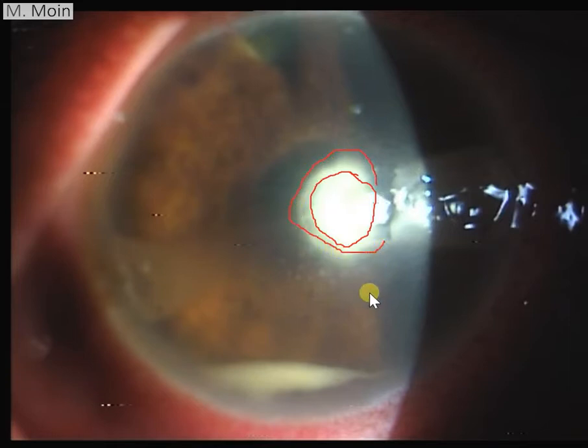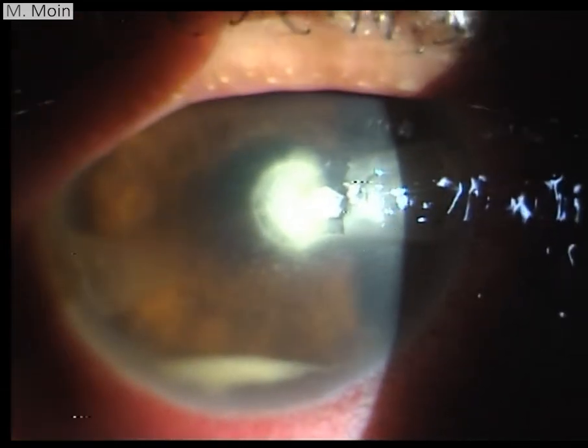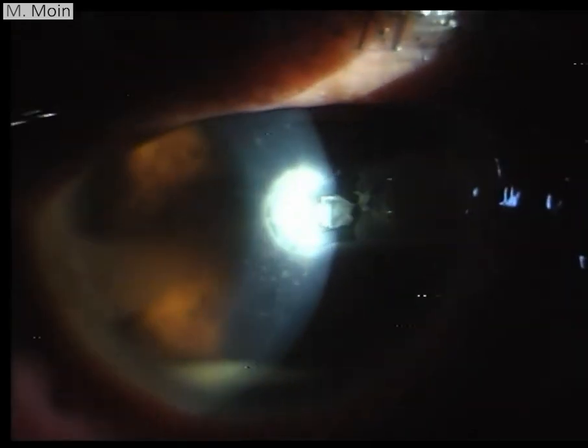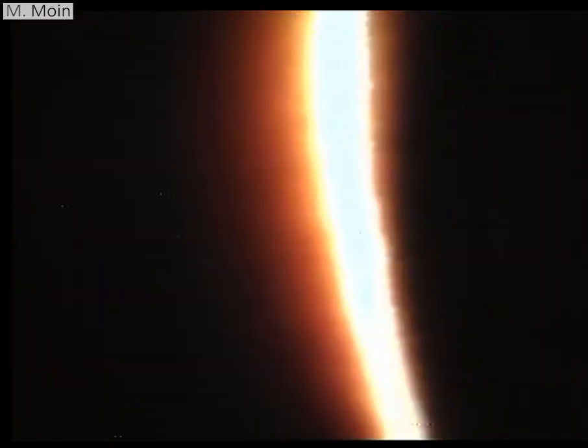So the other thing which you want to see is, is this a fungal ulcer? If it was, you would see satellite lesions going around. But you do see some areas of spots over here. Are these satellite lesions? Well, they were not. They were actually an area of mutton fat KPs which were present. So that was seen in this patient. So let's go forward and see ahead. This patient had a corneal ulcer which had induced enough keratitis to produce a hypopyon and keratic precipitates, and that was what you were seeing in this patient.